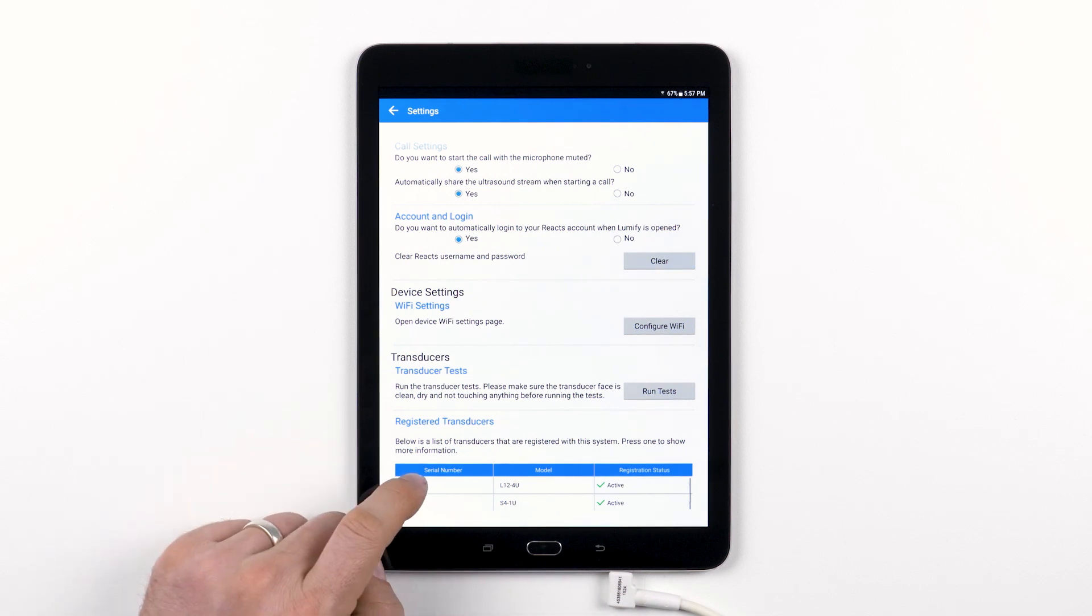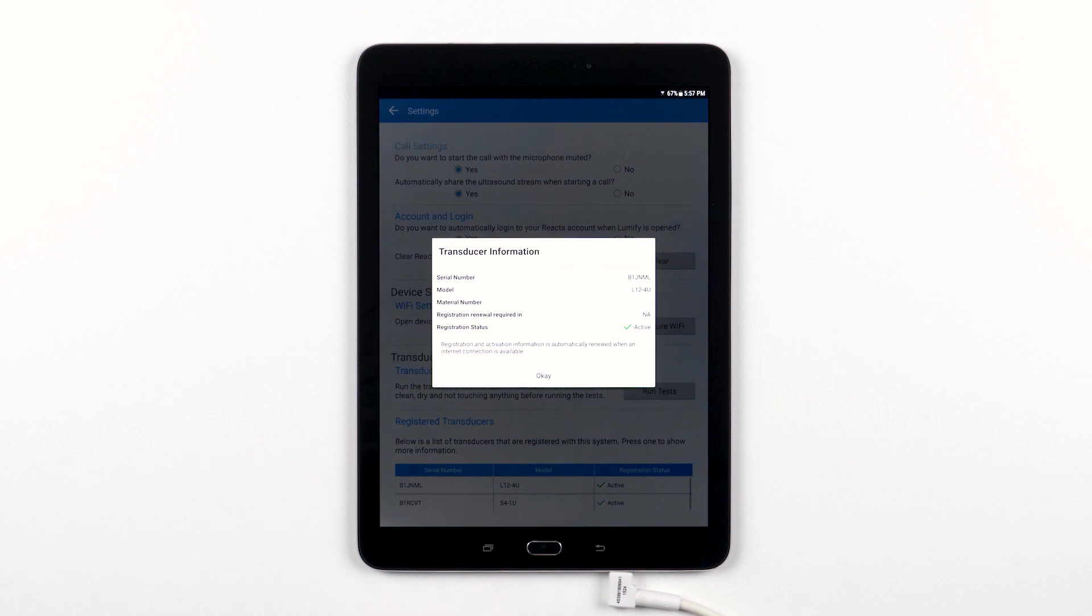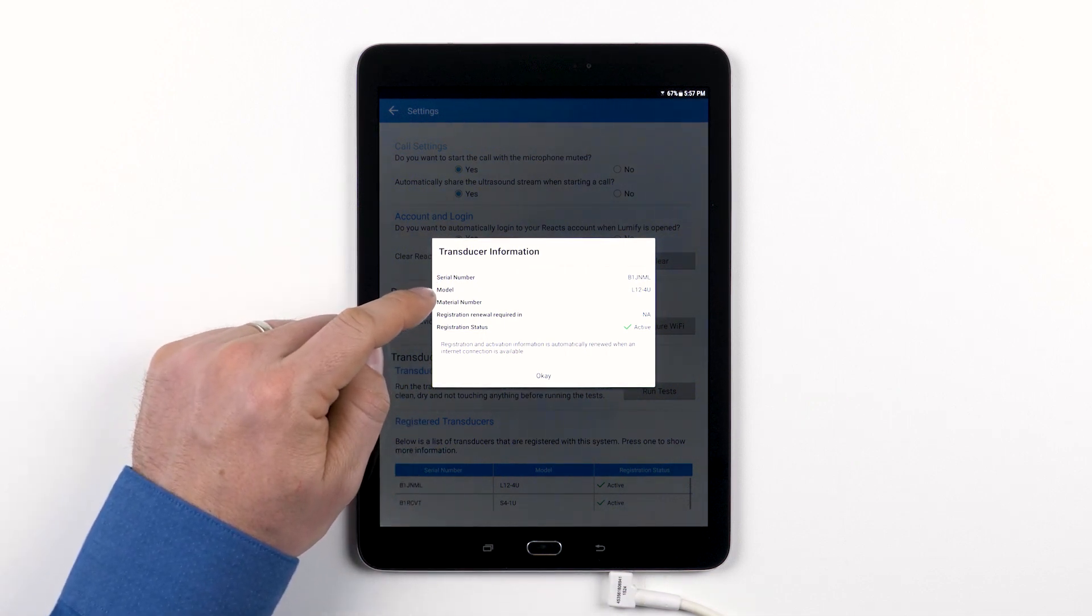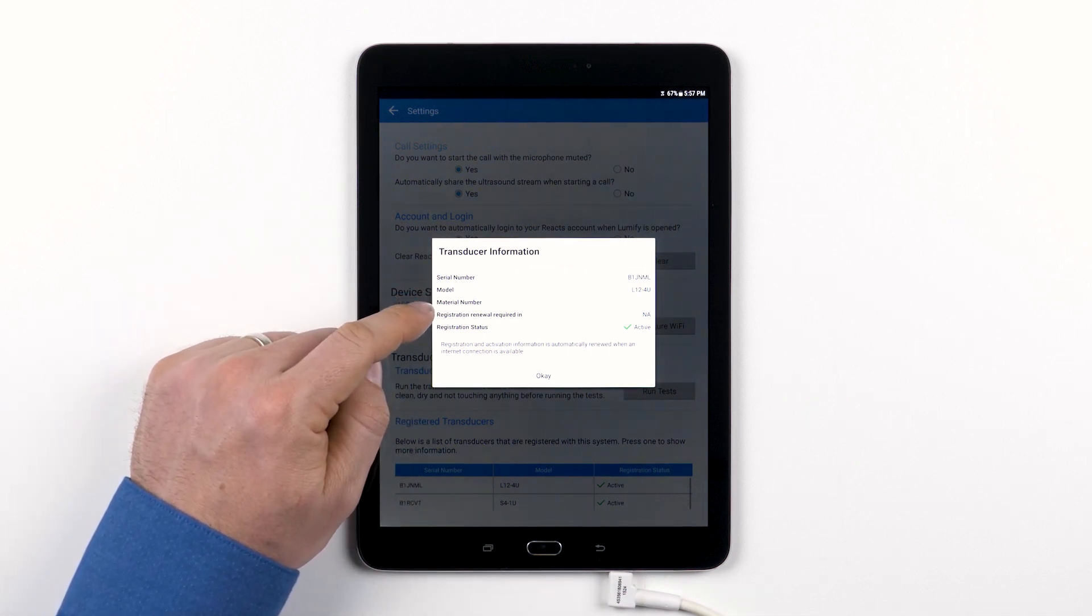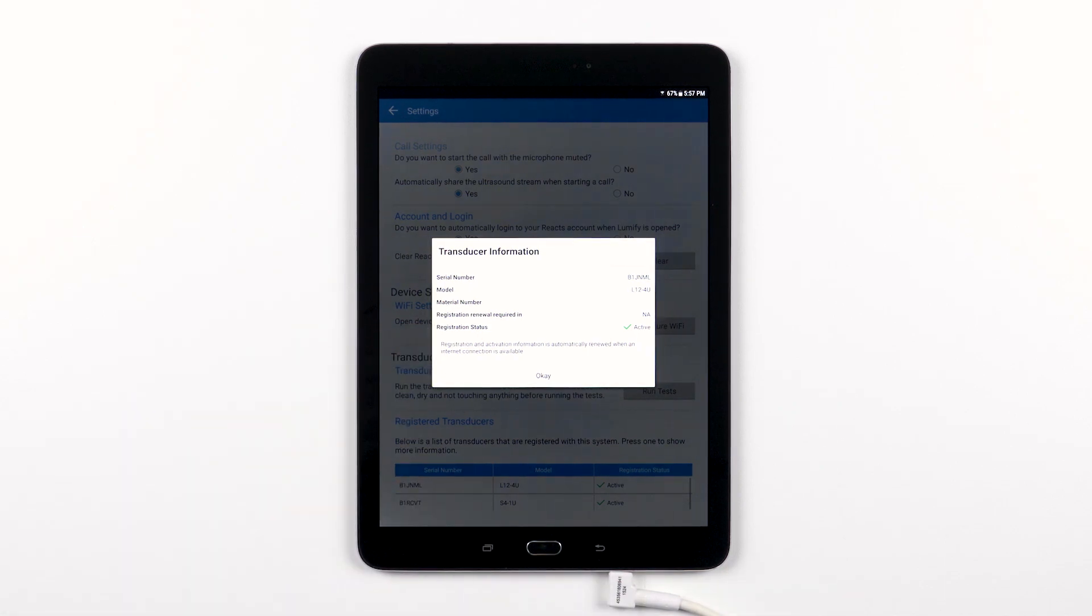Tapping on one of the transducers in the table will bring up more information about the transducer: serial number, model number, material number, and how many days you have left to renew your transducer registration.